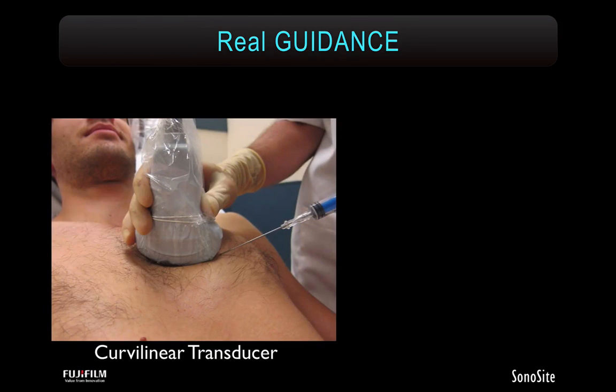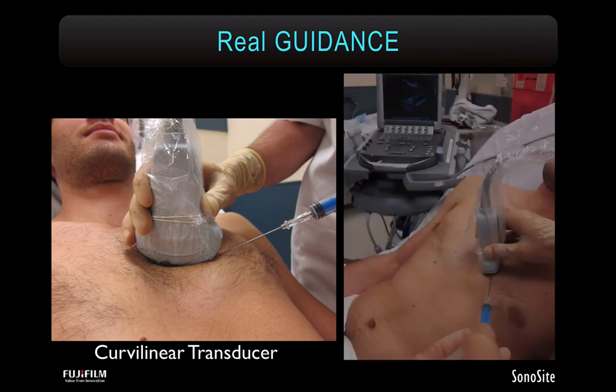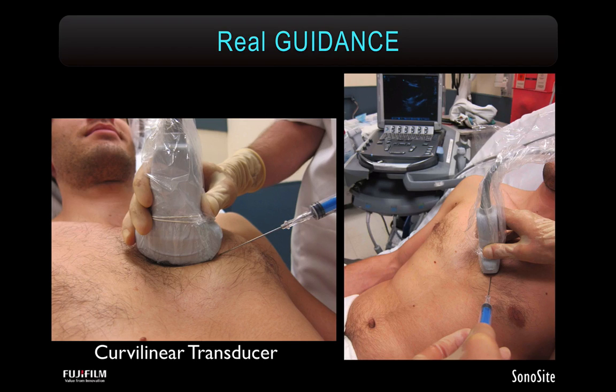I can send you to textbooks which give you a 40-step technique, but I don't think any of us memorize that. We don't have textbooks out when we're trying to stick a needle in somebody's heart. I think we should make this easier. I use a curvilinear probe. I slide up right to where I get a parasternal long view, and have the ultrasound machine on the contralateral side, so I don't have to look around for the machine. It's in my plain line of sight.